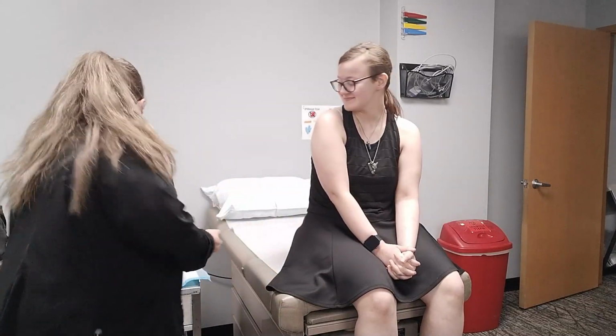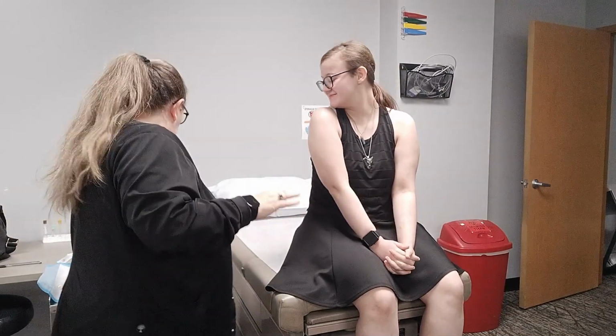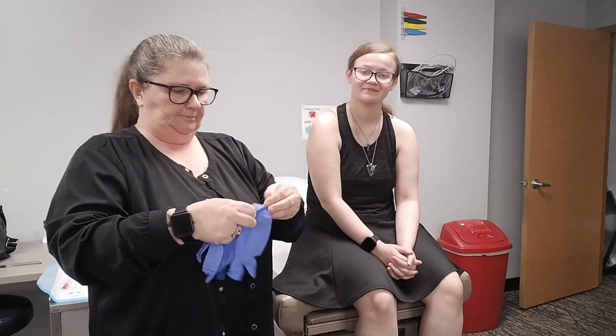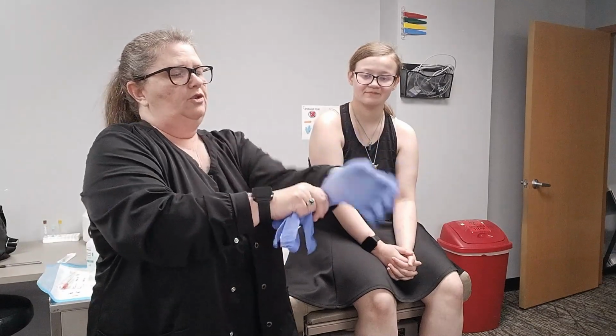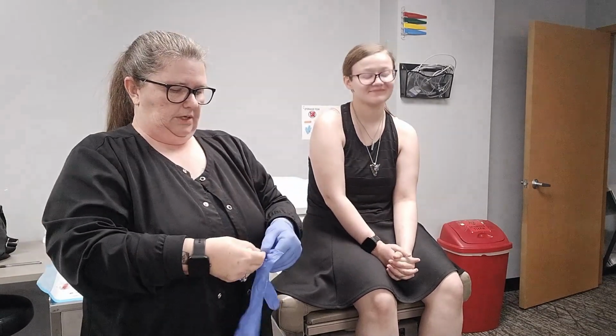So first thing I want to do is we're going to go ahead and wash our hands. I'm going to use some hand sanitizer. Okay, we're going to get some gloves on. Always safety first. All right.